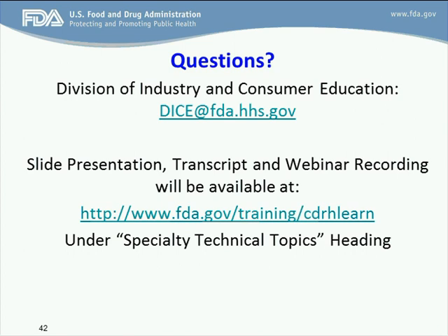So we are recommending that you provide a minimum of 2. I mean, if you use 3 and provide that information, that's fine, but our recommendation is to provide a minimum of 2, like protein and hemoglobin, or total organic carbon, any 2 quantitative markers.